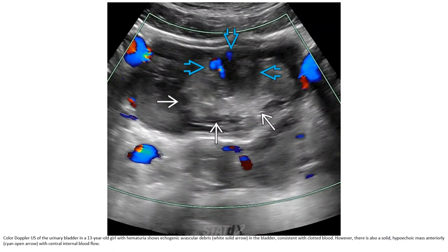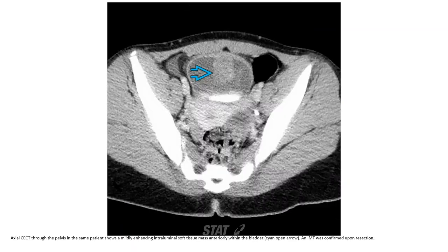Ultrasound of the urinary bladder in a 13-year-old with hematuria shows echogenic material within the bladder consistent with clot blood. There is also a solid, hypoechoic mass with central internal blood flow. Contrast CT through the pelvis in the same patient shows a mildly enhancing intraluminal soft tissue mass within the bladder. IMT was confirmed upon surgical resection.